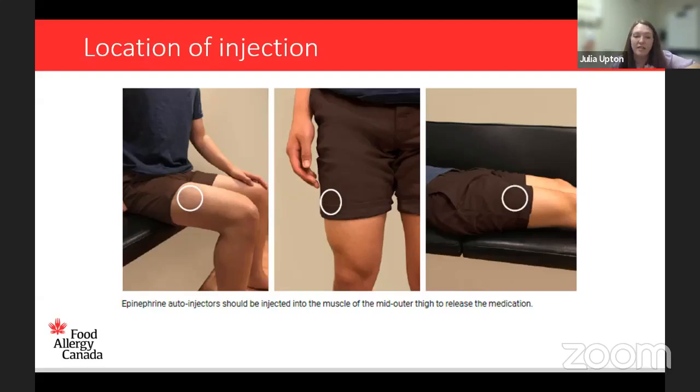And this is nice because we have different pictures in different locations. Another place that's kind of helpful is that it's often where your arm naturally falls, which I'll show you when we do the demonstration.